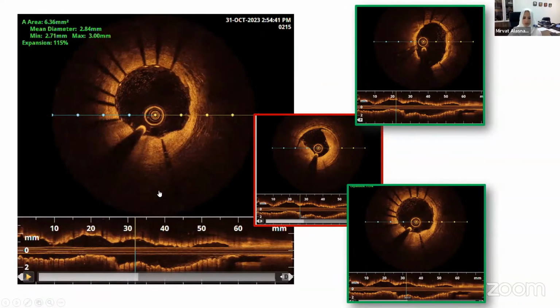So I took some still frames because it was a very short segment, but I can tell you this is how we picked it up, especially when there's a little bit of calcification, especially, you know, you're not exactly zoomed in. We're trying to use fluoro a lot more nowadays to minimize radiation and so on. But look at the mistake that we ended up doing.